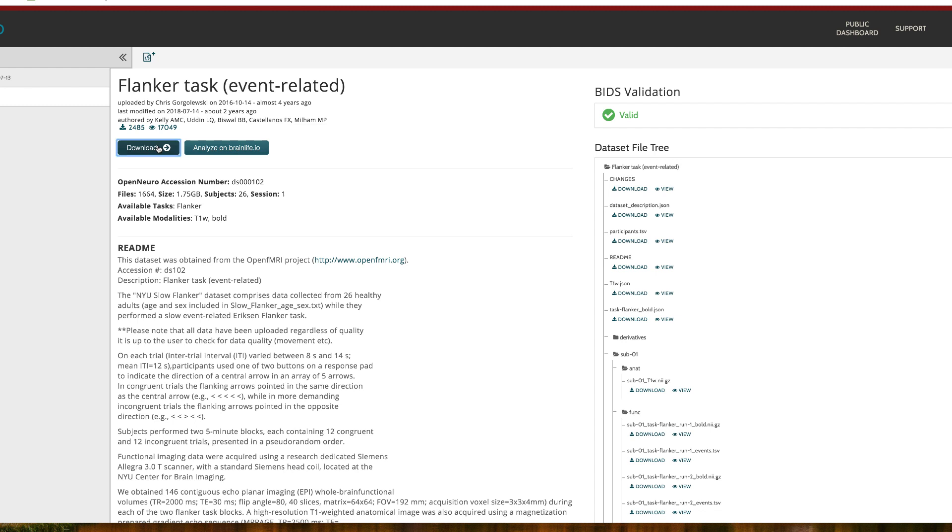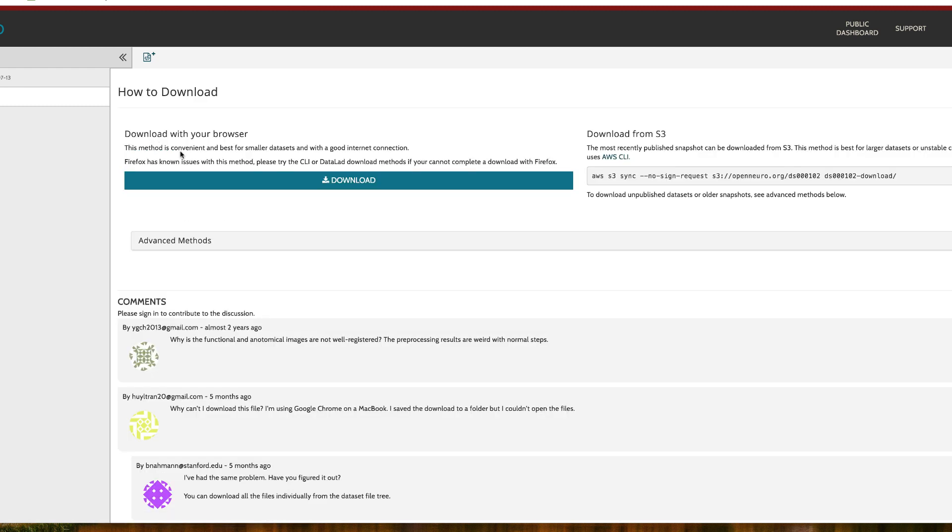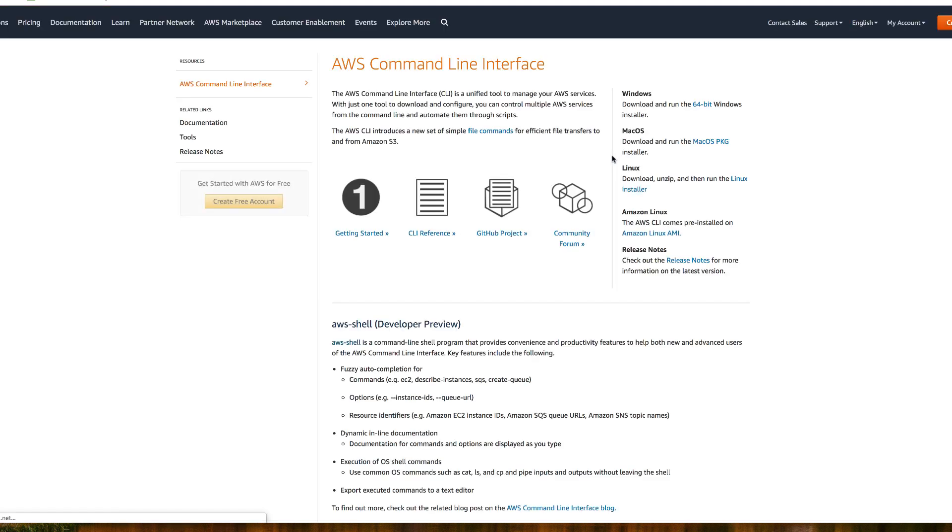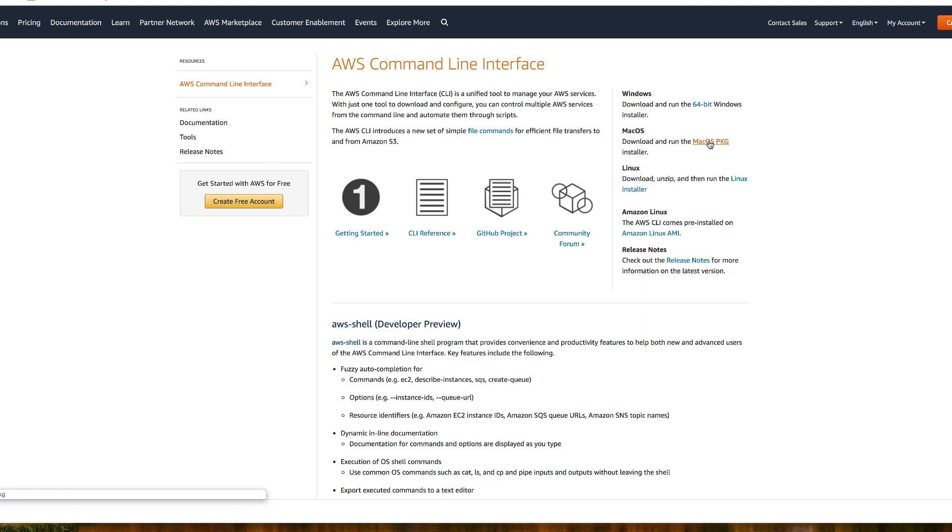Now, download the data set by clicking on the download button at the top of the page. The data set is about 2 gigabytes and comes in a zipped folder. If the download button doesn't work, try using the Amazon Web Services option.